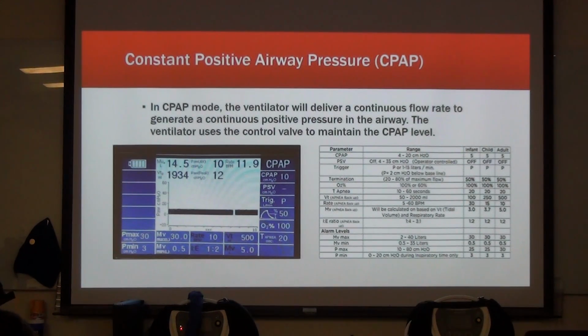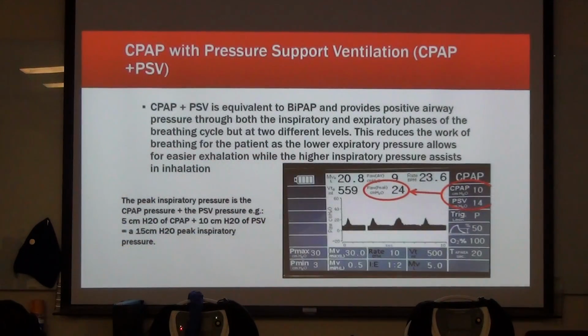But going back to this, PEEP 10, no pressure support yet, so that's blank, and then the rest of this is what we're looking at. This is what you're used to using all the time. But then we're going to move into this one.